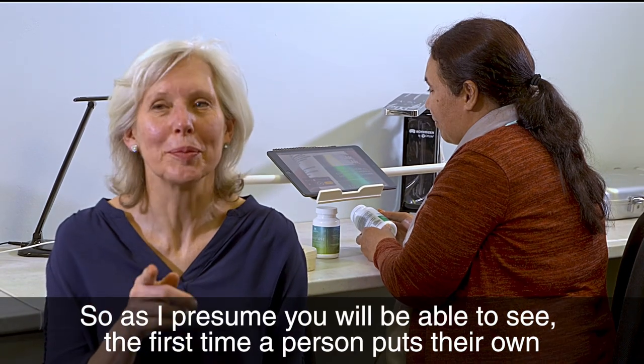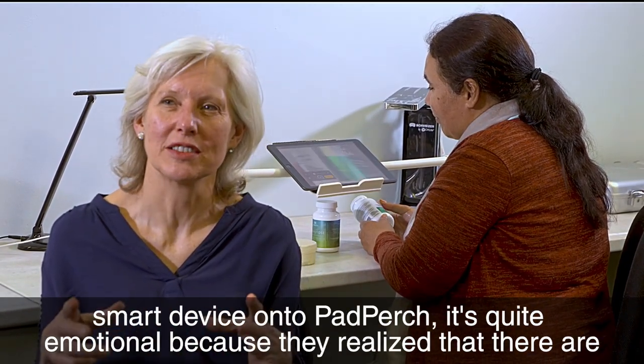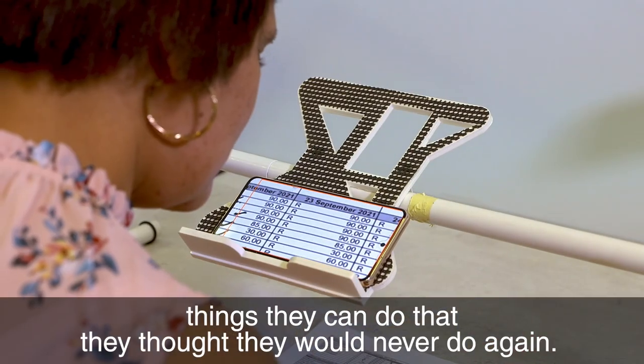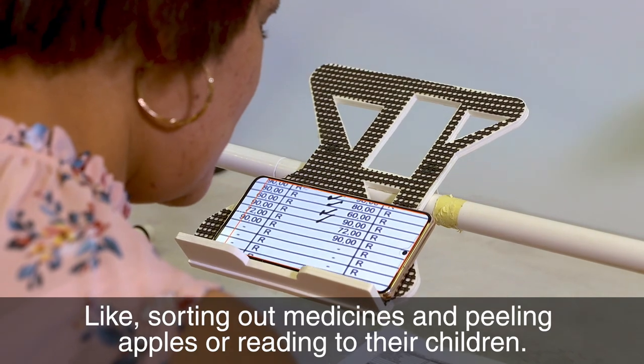As you will be able to see, the first time a person puts their own smart device onto PadPerch it's quite emotional, because they realize that there are things they can do that they thought they'd never do again — like sorting out medicines and peeling apples or reading to their children.